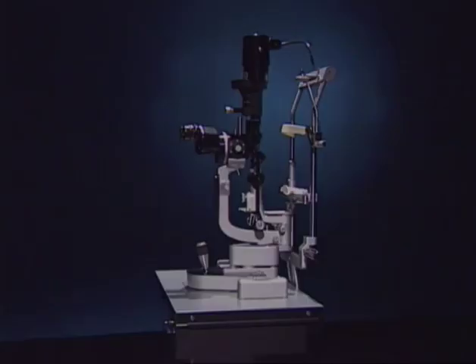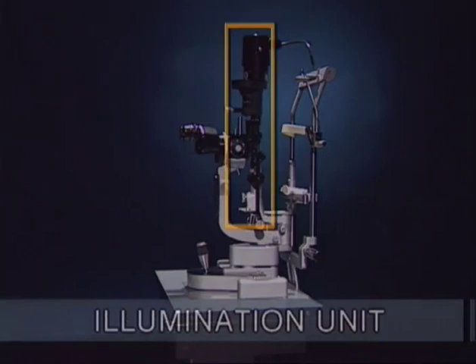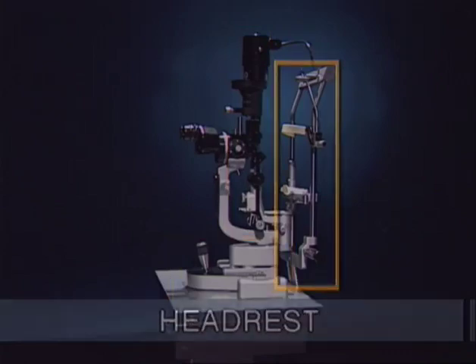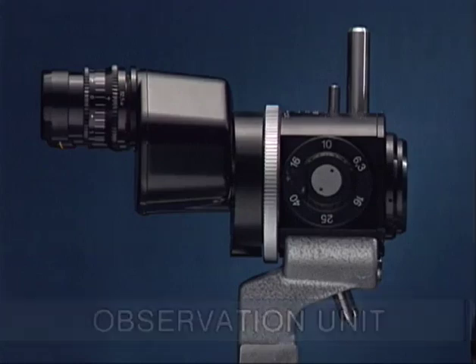A slit lamp has 4 components: the observation unit with the microscope, the illumination unit, that is, the actual slit lamp, the moving instrument base with the slide connecting the 2 units, and the headrest for the patient. This is the microscope.